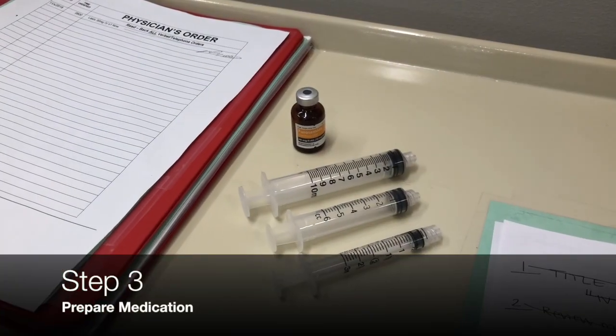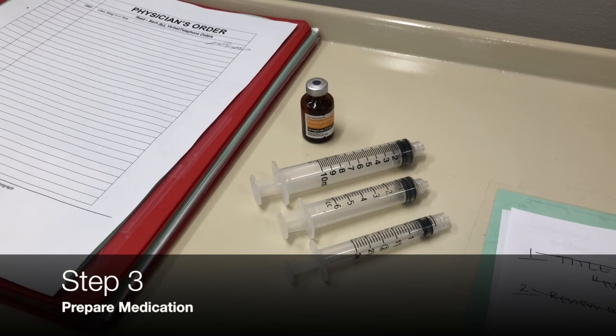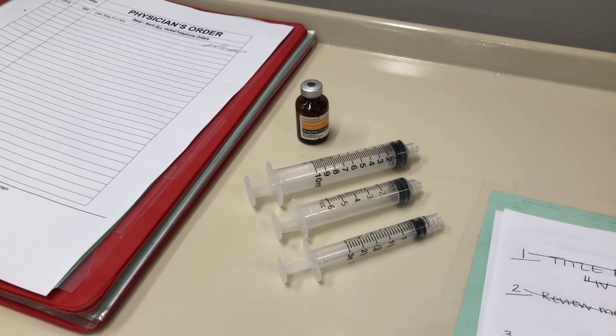Knowing that I need 3 milliliters of the Lasix, I will choose a 3 milliliter syringe over the 6 milliliter or 10 milliliter syringe.